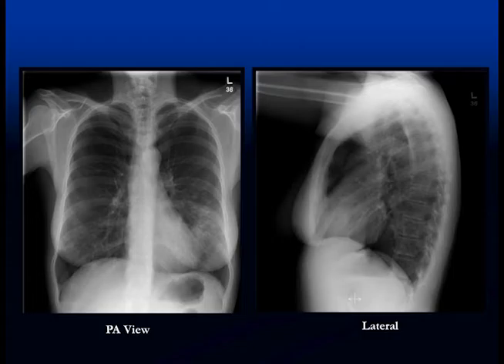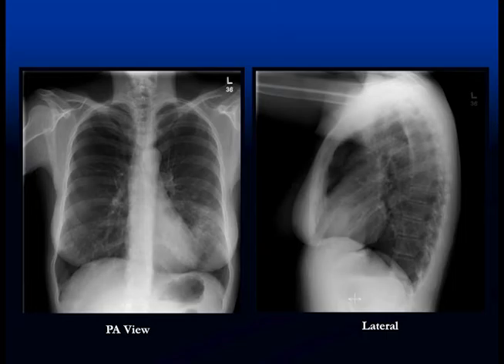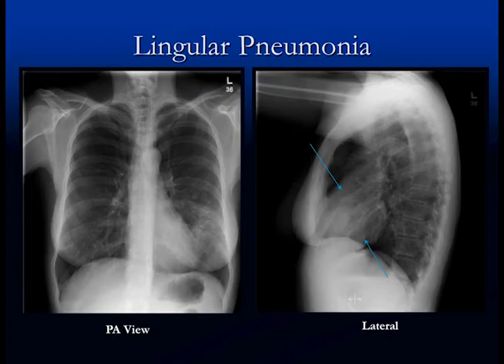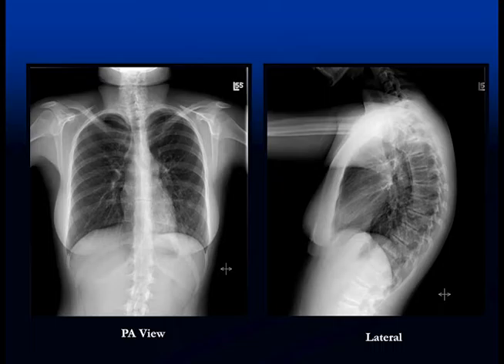Here we can see the right atrial border, right diaphragm, and most of the left diaphragm, but we've lost the left heart border. There's an area of consolidation that's blurred out. On the lateral film, there's an area of increased soft tissue density — this is a lingular pneumonia. Sometimes it's difficult to see on the lateral view, but on the PA view, if you don't have the heart border, then there's consolidation in the lung.